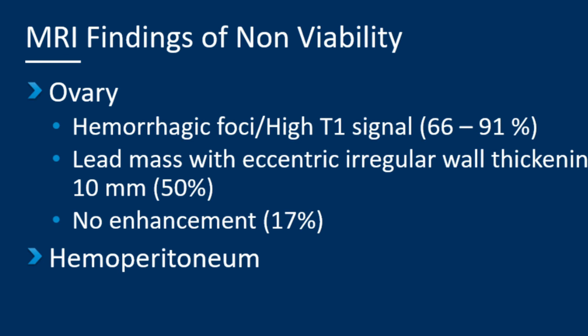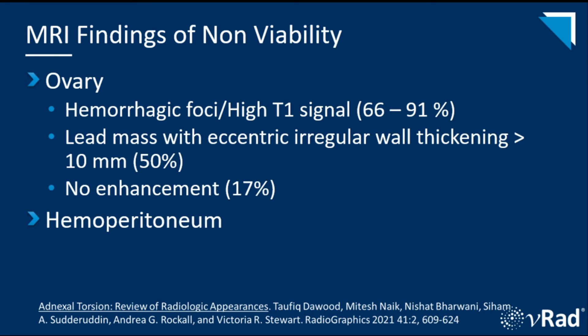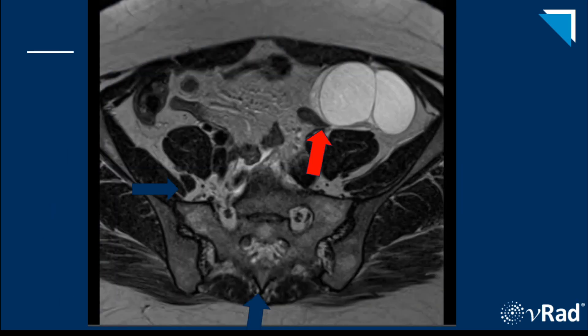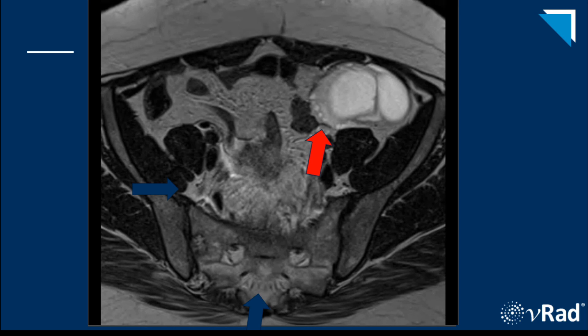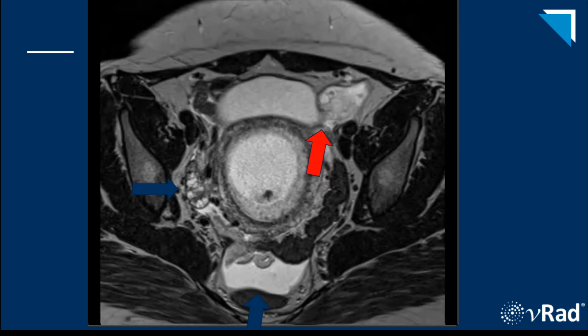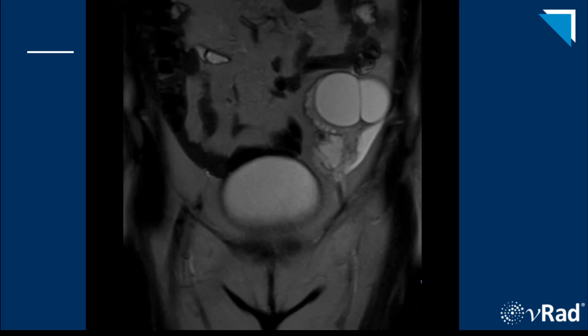A hemorrhagic ovary is a non-viable ovary. On MRI, hemorrhagic foci manifest as high T1 signal, seen the majority of the time, along with a lead point mass with eccentric wall thickening greater than 10 mm in approximately half the cases, and lack of enhancement. Hemoperitoneum is again associated with non-viability. These T2-weighted axial images show the left ovary massively enlarged containing large simple-appearing cysts, with dependent free fluid and a normal-sized right ovary. The coronal images clearly show the twisted left adnexal pedicle, leaving no doubt that this is adnexal torsion.